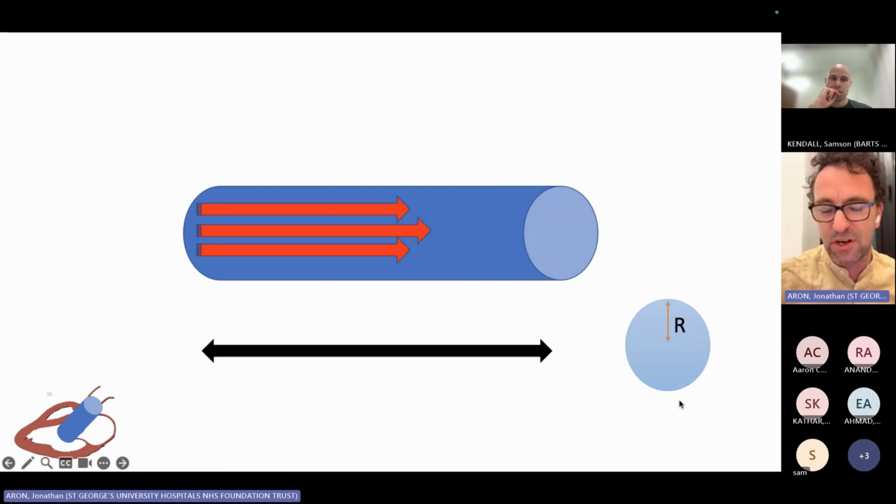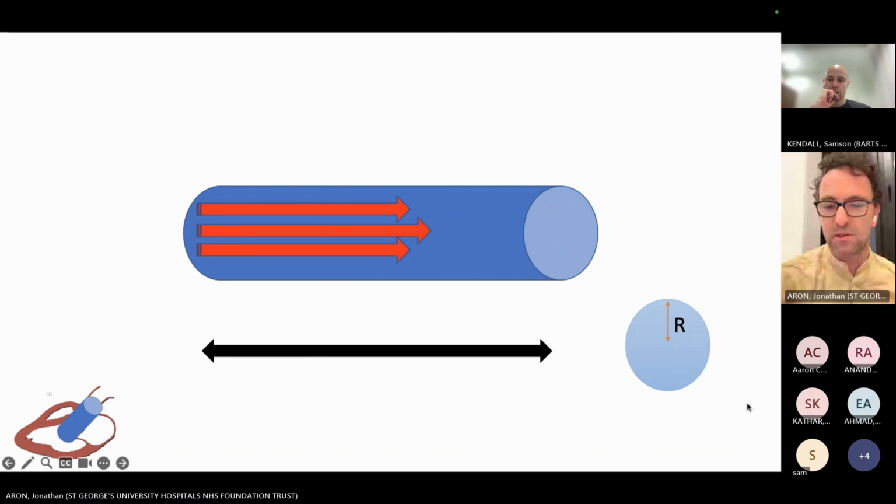The nice thing about the left ventricular outflow tract is that it's roughly cylindrical, circular in cross section, and it stays roughly the same size throughout the cardiac cycle, which is helpful for calculating the stroke volume. So the radius you see there, 2 pi r, I beg your pardon, pi r squared, is the area of that circle, times this distance gives you the volume of this tube.